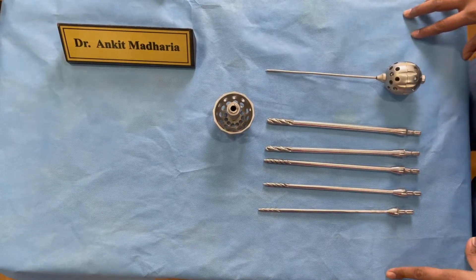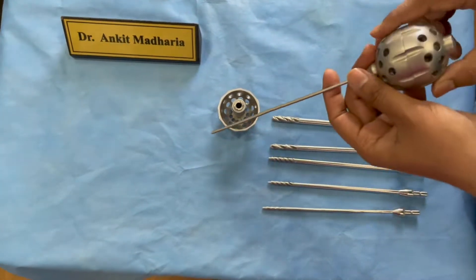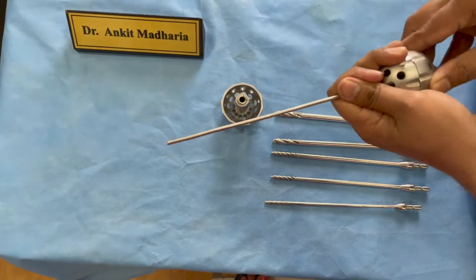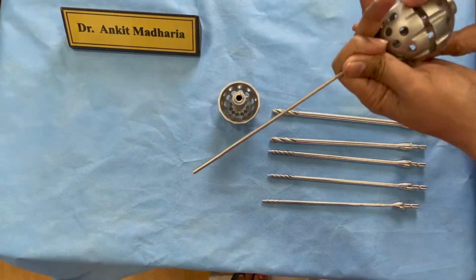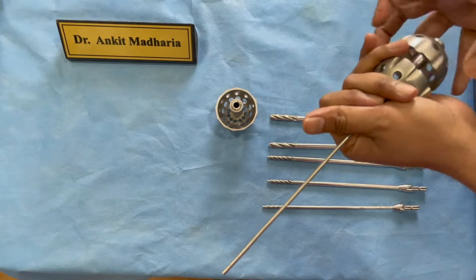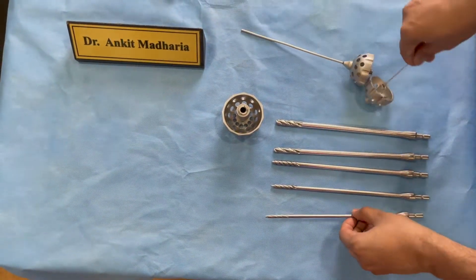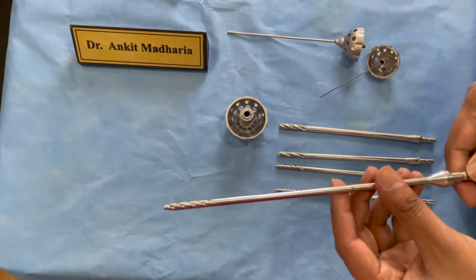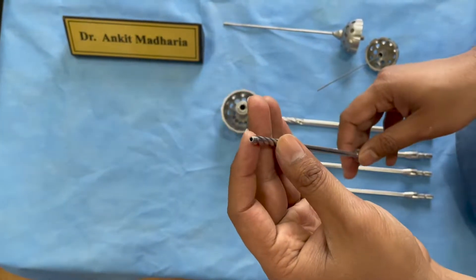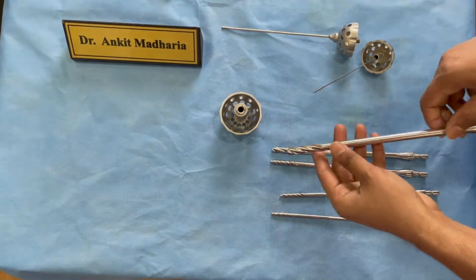This is a set of facet rimmers used for an outside-in technique. You dock your needle at the SAP, put in a guide wire, remove the needle, and sequentially start reaming the superior articular process. This is a 4mm reamer and we can sequentially increase its size. The specialty of this reamer is that it is blunt at the tip with no sharp tooth, so it only cuts on the side. It comes from 4mm up to 9mm.